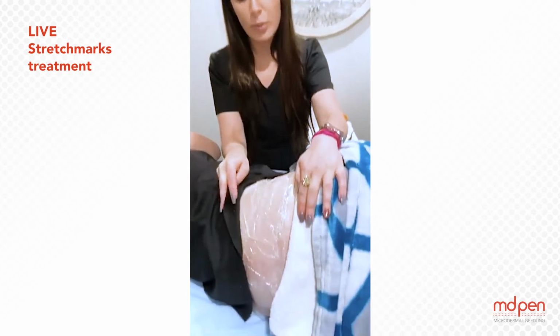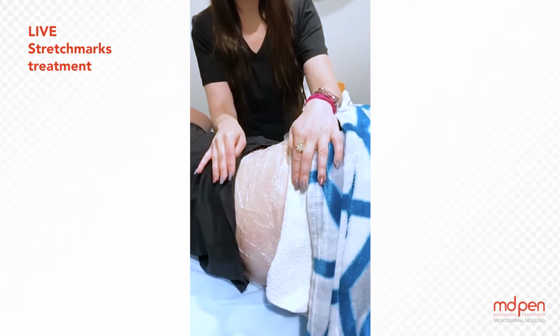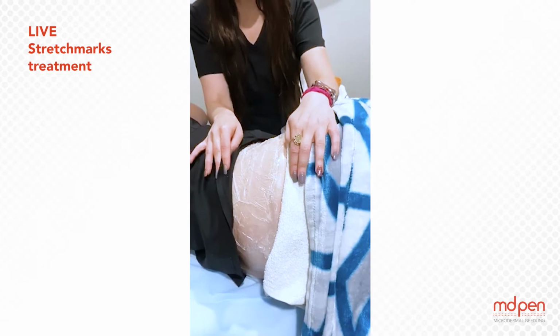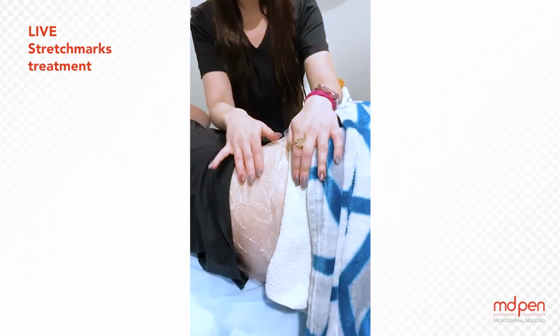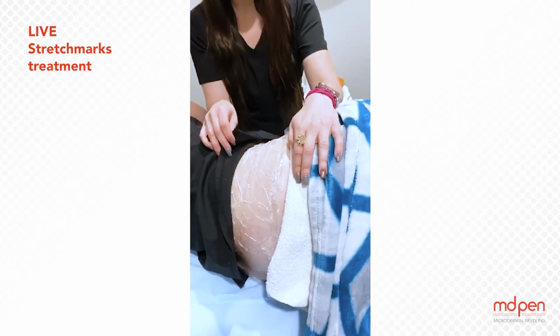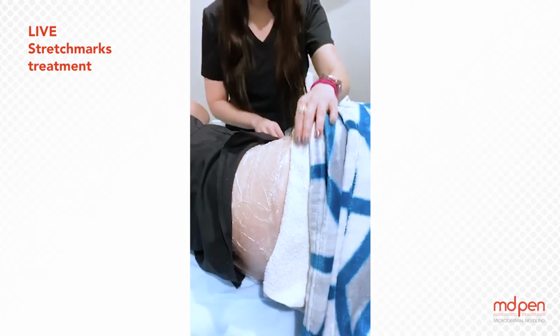I've numbed her topically with a prescription grade topical numbing. You do want to numb really well for stretch marks and scars. They could be more sensitive than other areas. She's been numbing about half an hour. I did cover her with plastic wrap, and we will have to fully cleanse this area and wipe it with alcohol prior to treatment.